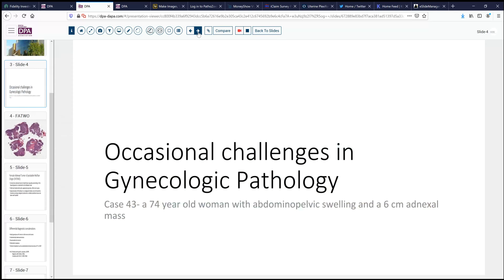Our case is again a GYN case — that of a 74-year-old woman who has developed some abdominal pelvic swelling and is found to have a six-centimeter adnexal mass. Certainly at that age group, something in the adnexa is likely to be malignant, and that was the primary concern.